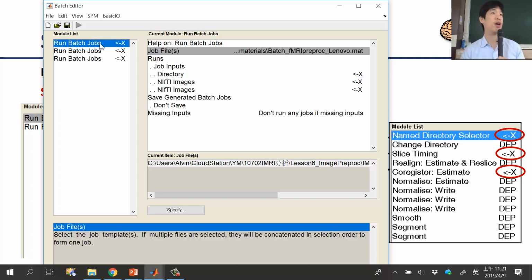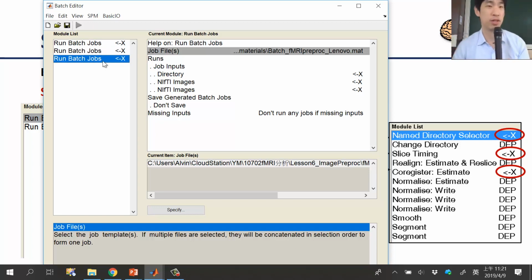For example, I have one participant that we collected in week 5. We have 1 back, we have 2 back, we have resting state. We can have more. We have picture naming, we have motor section. You can copy as many as you want, depending on how many sessions you are going to process.